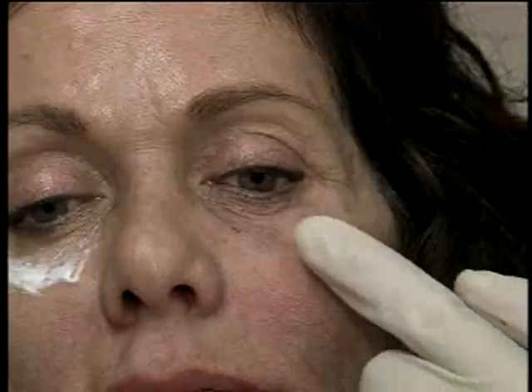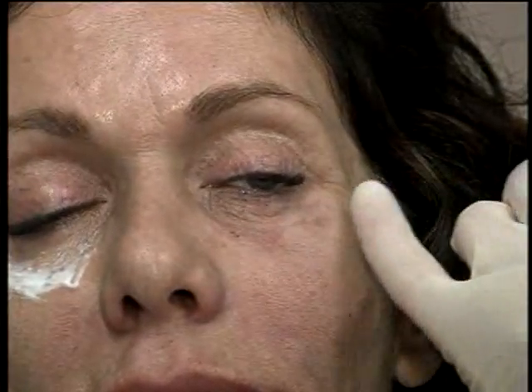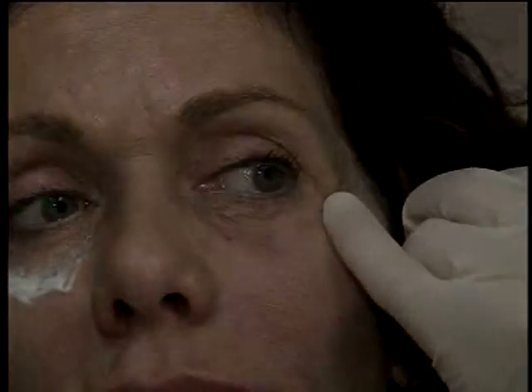Okay, so that's it for treating under the eye. Once again, undercorrect is the important point. Okay, and we'll give that about 2 weeks and see how that looks. Over the next 2 weeks, I find that the area gets better and better.